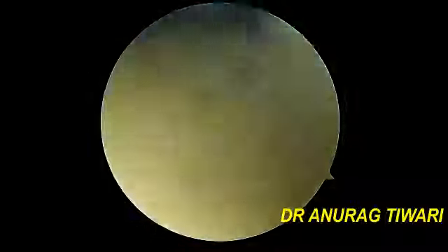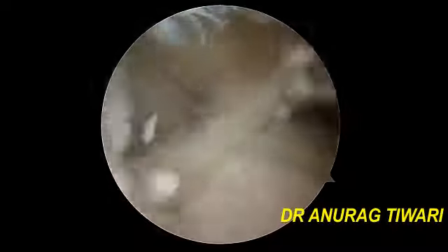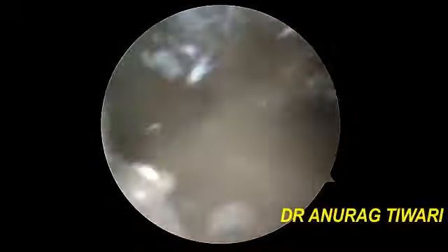So this is on the lateral compartment side, the extra fat pad and the synovium is just getting shaved off. Once the fat pad and the extra synovium gets shaved off, you will be able to see a clear picture of the entire knee. So on the front side, you are seeing the lateral femoral condyle. On the inferior side, you are seeing the tibial articular surface, or the superior surface of the tibia.